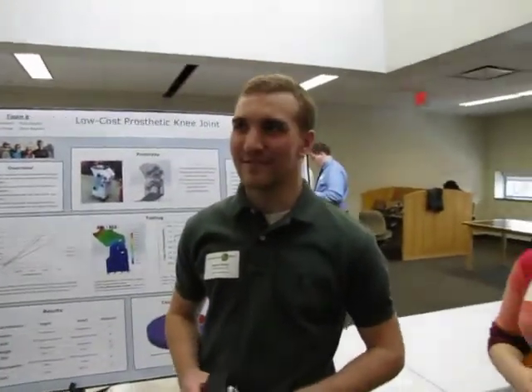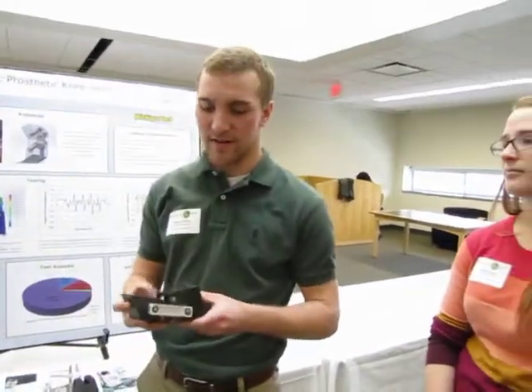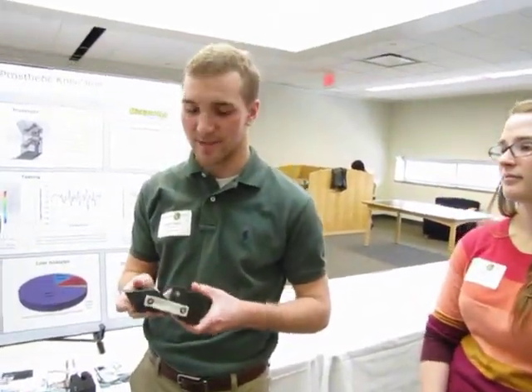I'm Bobby — I'm in the Biomed department, but this is a mechanical project. Last year's knee, which this is an improvement off of, was really bulky — about twice this size — and it didn't bend with as much flexion as our customer would like. We worked with the hospital in India and they said it was too expensive, too bulky, and people didn't like it over there.